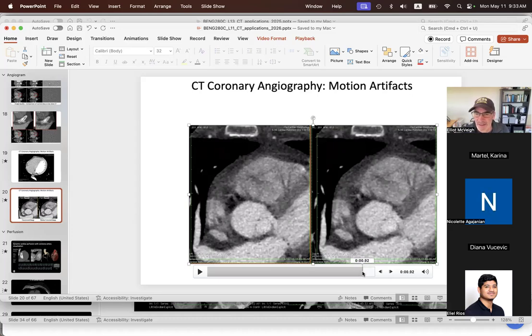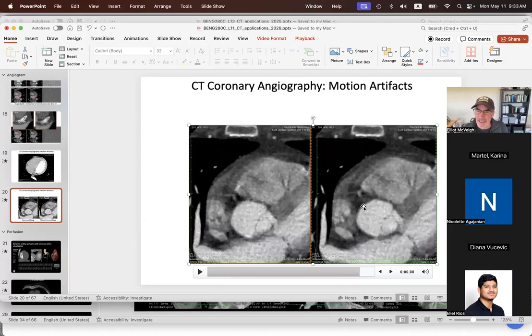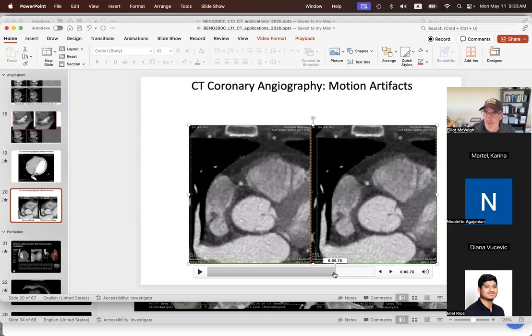Now you can go back to that data and change the sinograms by stretching or contracting them in time, depending on the motion of the point. So if you know the motion of the point, you know how the sinogram is going to be distorted, and you can apply the opposite of that effect to undistort it. And you can do that locally for, say, a coronary artery.